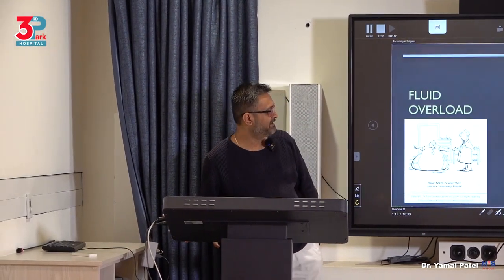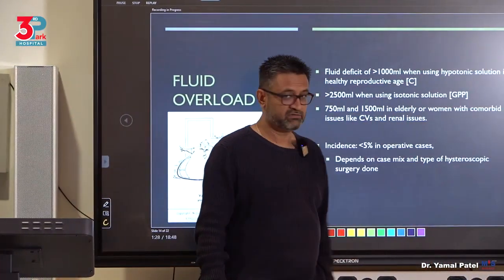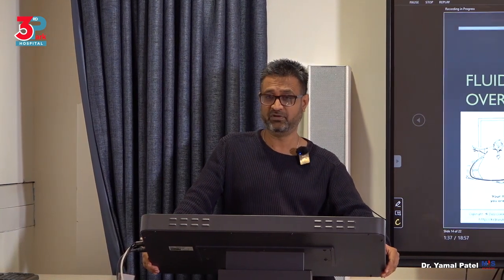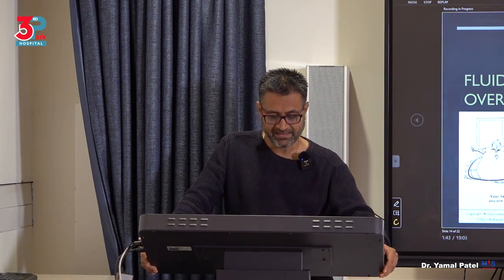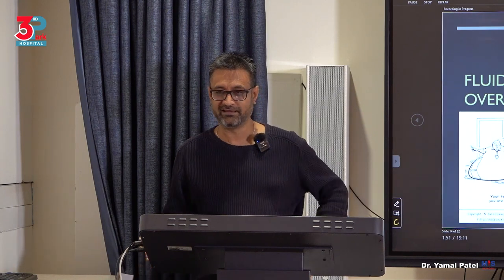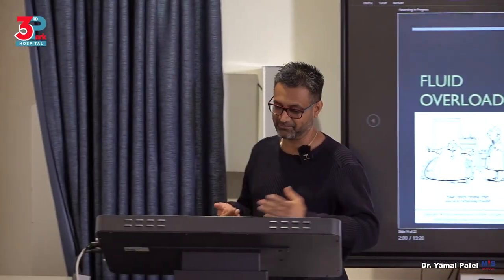If you have an elderly woman or a woman with comorbidities like cardiovascular issue or renal issue, then your cutoffs are 750 and 1,500 ml respectively for hypotonic and isotonic solutions. Make sense? So it's no longer 1 liter and 2.5 liters. It's 750 and 1,500. The incidence is less than 5% in operative cases, but that is if you follow these rules. If you don't follow these rules, you can be one of the masters of causing fluid overload every time you operate. So it's up to you. You want to be a master in that or not is up to you.